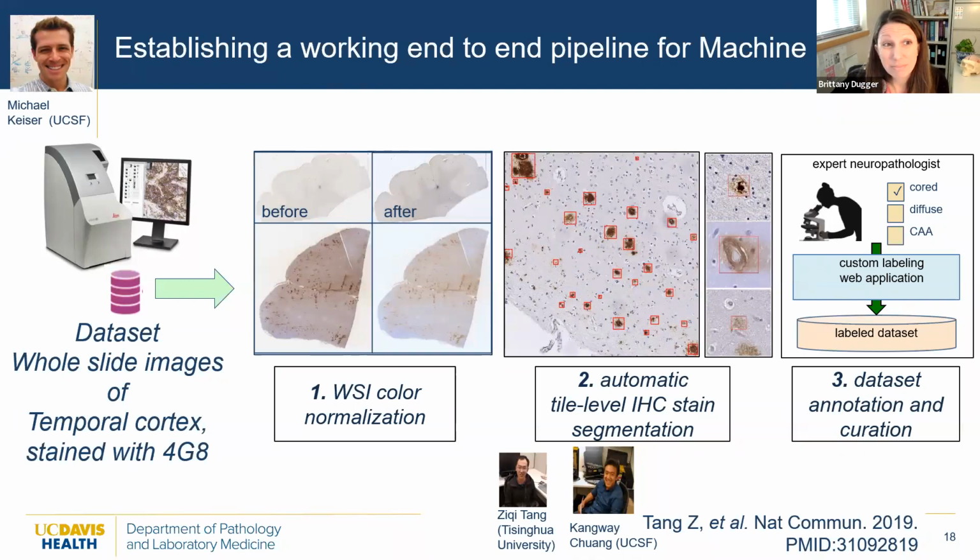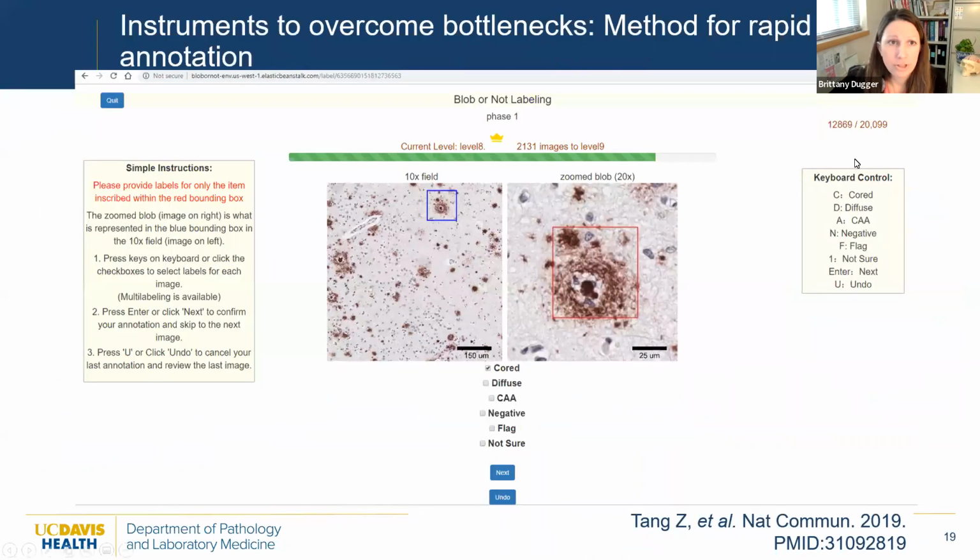So one of the big bottlenecks could be annotation. So one of the things we came up with, so typical annotation, you get a file, you open that file, you mark it all up, you close it down, and then you can sling it to your collaborator. Multiply that by hundreds of images, by thousands of images. That's a lot of time. How can we speed that up?